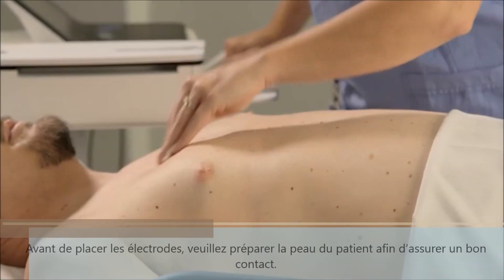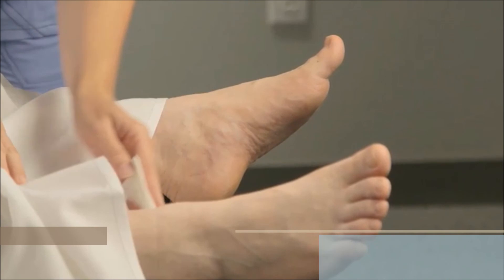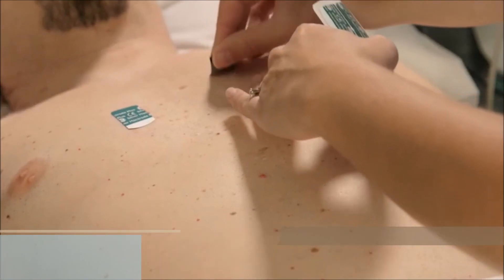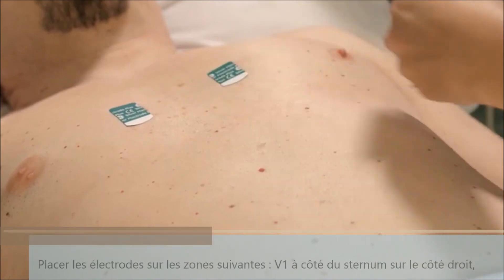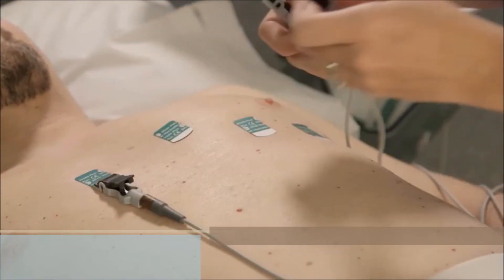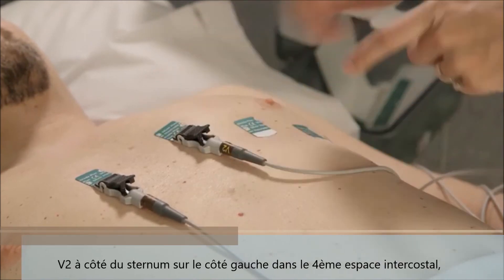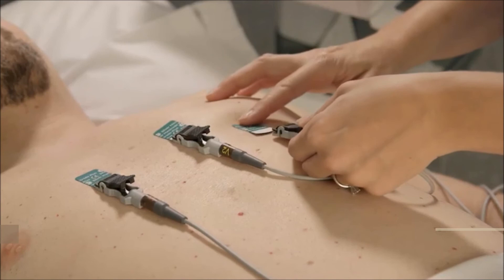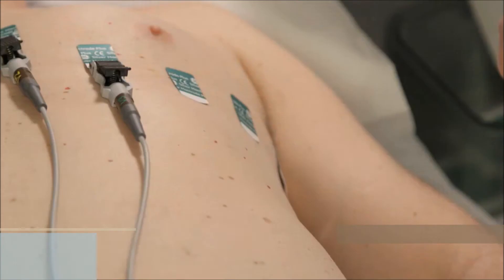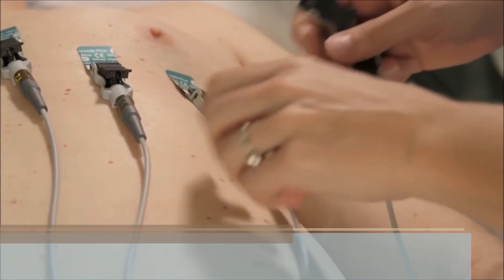Prior to placing leads, patient body hair must be removed to assure good contact. After hair removal, abrade the skin and cleanse with alcohol, then dry completely. Place the electrodes in the following areas: V1 next to the sternum on the right side; V2 next to the sternum on the left side — both at the fourth intercostal space. Place V3 midway between locations V2 and V4. Place V4 at the midclavicular line at the fifth intercostal space.